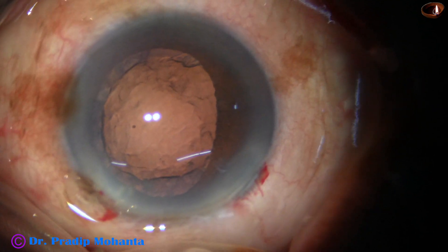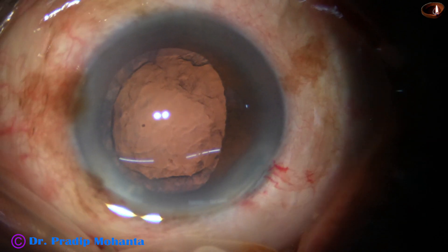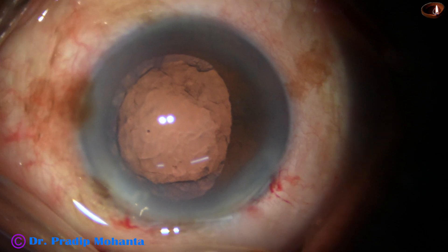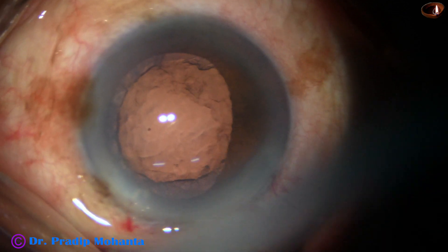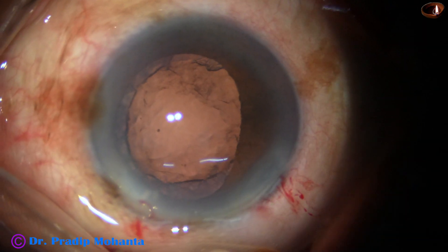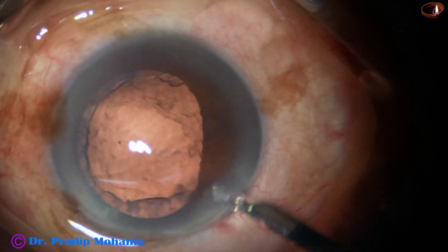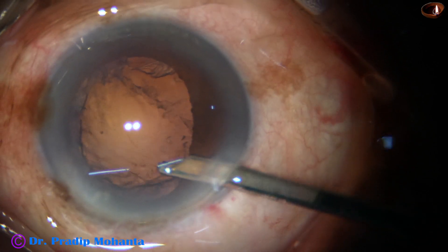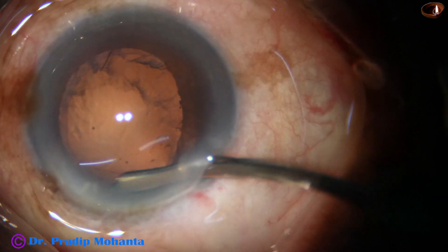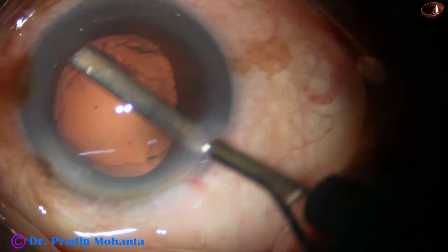Through this video I want to pass the message of using the epinucleus shell as a protective contact lens, protecting the posterior capsule in such cases. We have seen generalized weakness of the zonule in this case during capsulorrhexis. We could not pierce the center of the capsule with the tip of the utrata forceps; even with the sharp cystitome it was difficult. So in such cases it is more important to protect the posterior capsule, because the posterior capsule may come forward at any time.